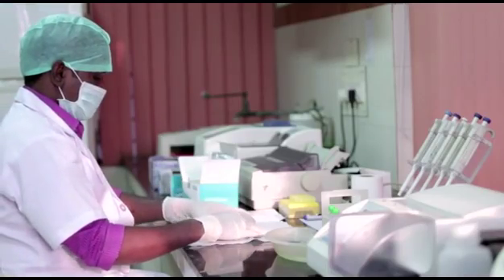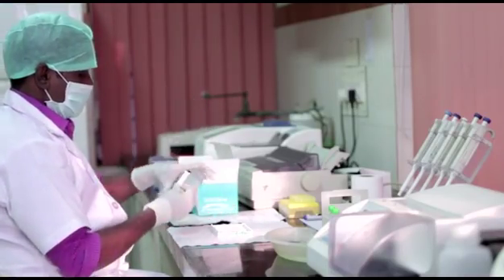Test procedure. Prepare wash and buffer solutions according to the manufacturer's instructions.